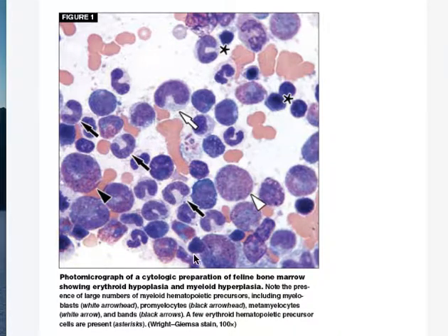These are all myeloid. They're pretty young. A lot of them look like they have granules in them, and all these guys are whites too. So this does look like more of a myeloid hyperplasia, and it is abnormal. So I wanted you to see both.